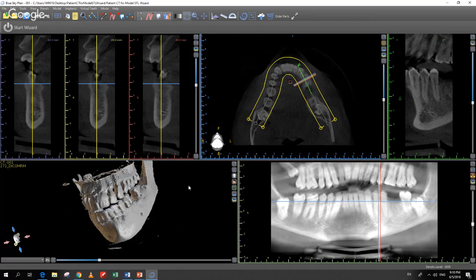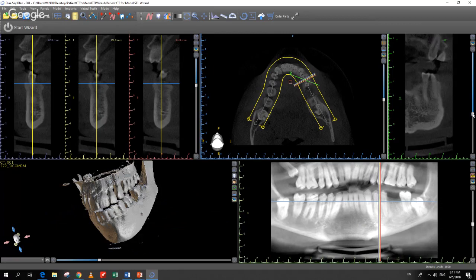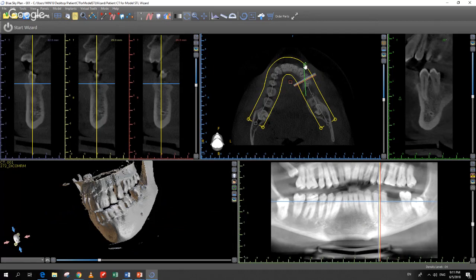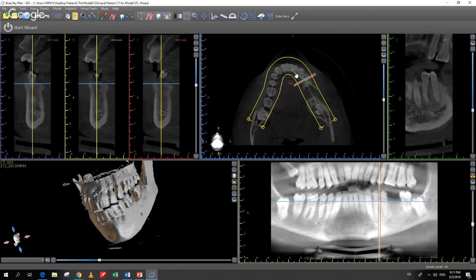The top right view is our tangential view. Its purpose is to show 360 degrees around a particular anatomy or implant. As you move through those slices, the green indicator in the axial view rotates accordingly, showing the exact angle being viewed in the tangential view. You can also change the angle by grabbing the green arrow with your left mouse button and dragging, and the tangential view updates accordingly.